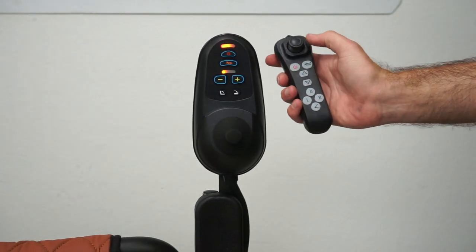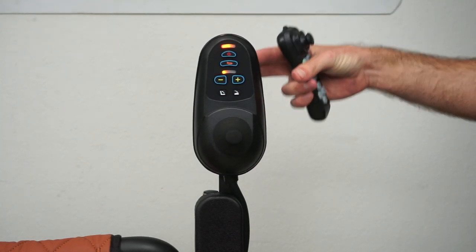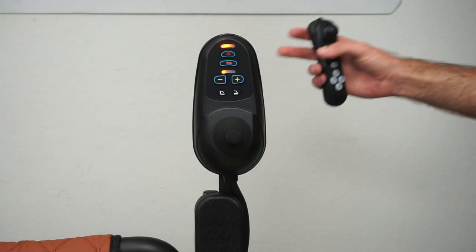And now they are paired. That is how you pair your remote control with your joystick on the Majestic IQ7000 Auto Folding Power Chair made by Comfigo.